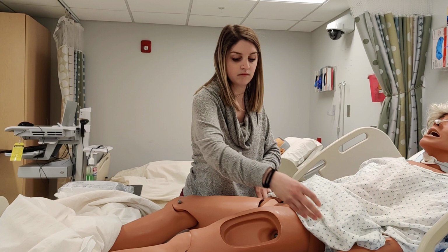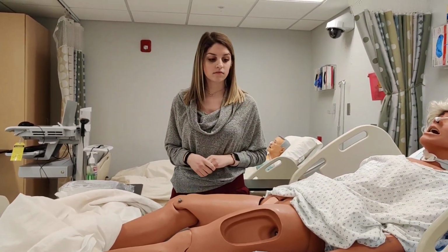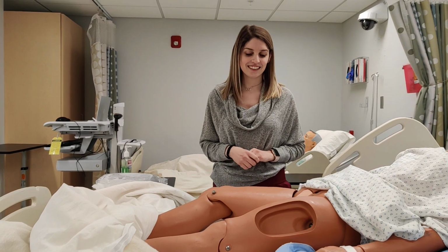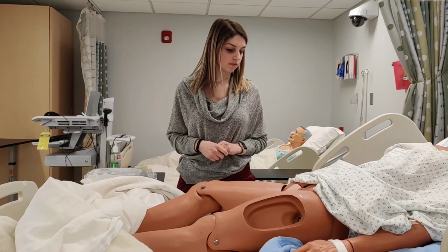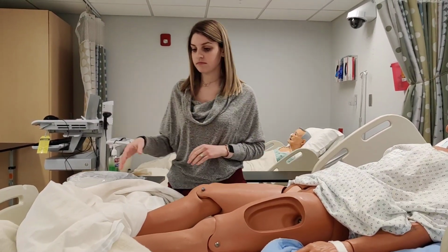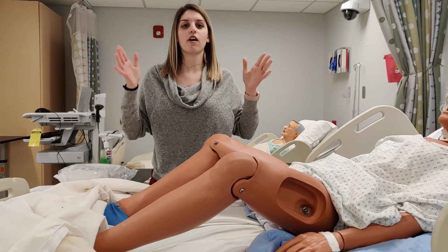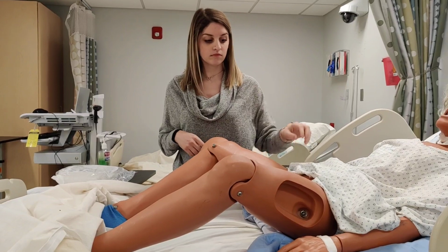The first thing we want to be sure to do is some good peri-care. That's something that you would verbalize for competency purposes. You won't have to worry about competency until next semester. So once that peri-care has been completed, you're going to position the patient appropriately. So for a female, we're bringing the knees up and out. I love the frog leg, guys. Right, and we're exposing that vaginal area.